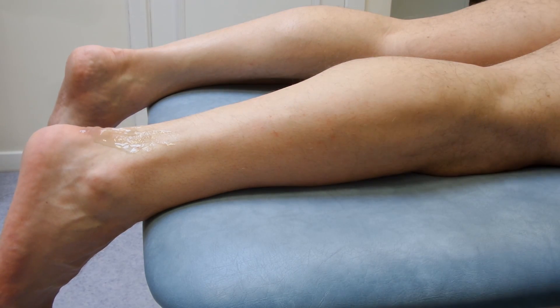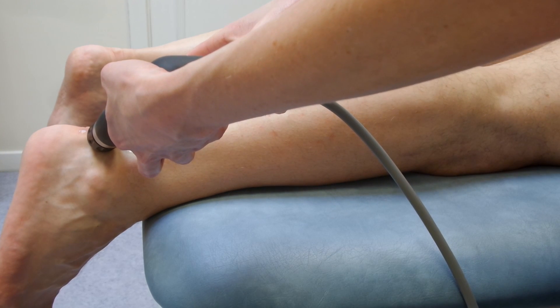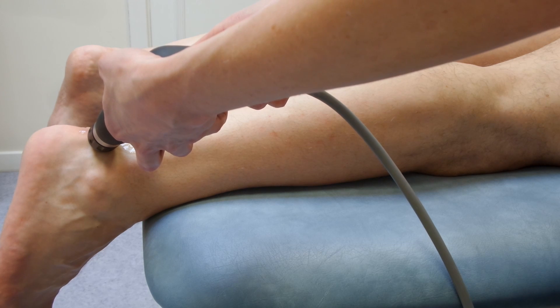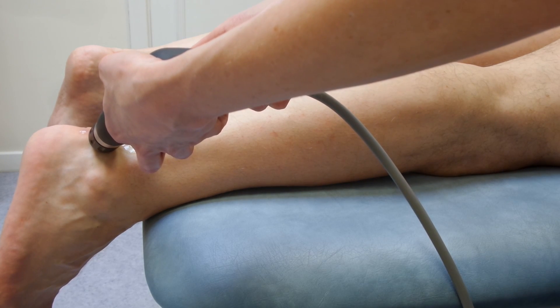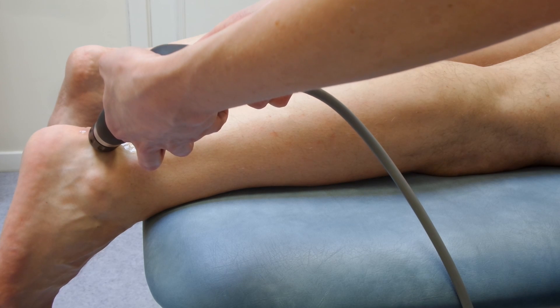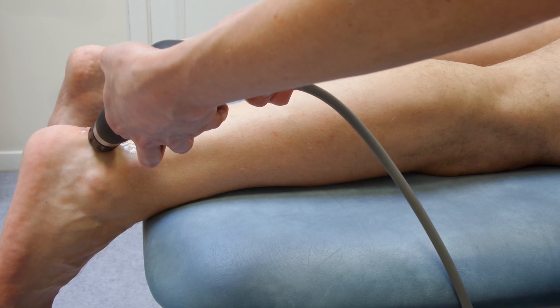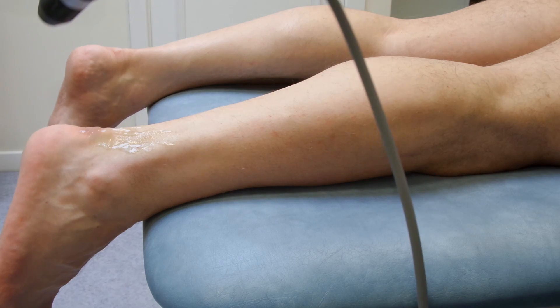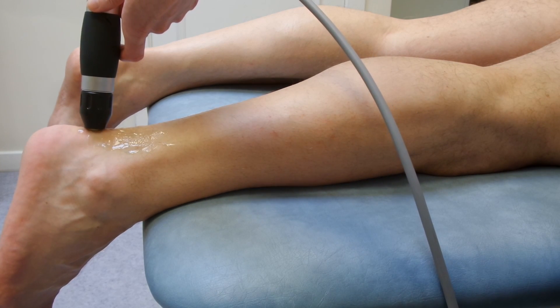Once you've done 200 spots to one area, you can go the opposite way and do 200 spots back through from the opposite side. The benefit of doing the shocks in this way is that the skin gets a chance to recover in between sets of shocks, and of course you hit the spur from every angle — which is quite an important thing when you're trying to break down pieces of what are essentially bone or calcified scar tissue.